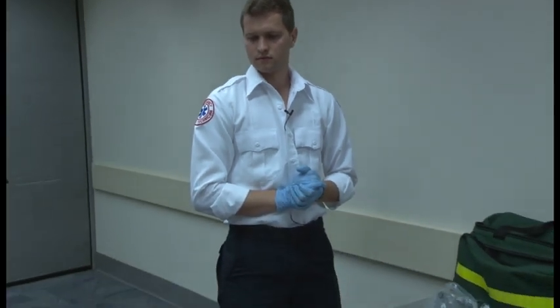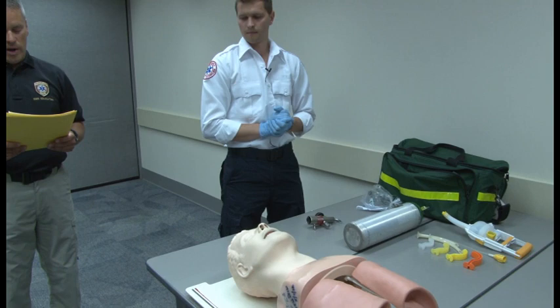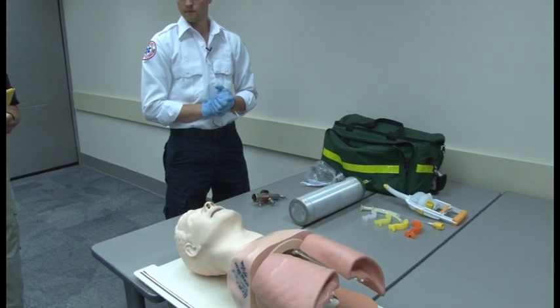A 45-year-old male is short of breath. His lips are cyanotic and he is confused. You have five minutes to administer oxygen by non-rebreather mask. Your time starts now.